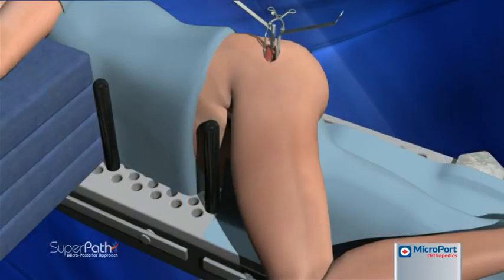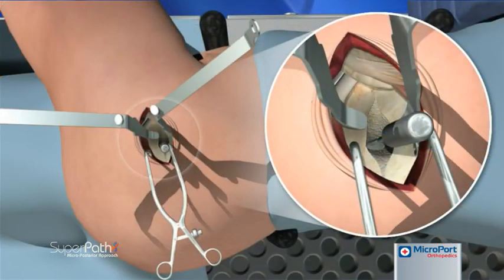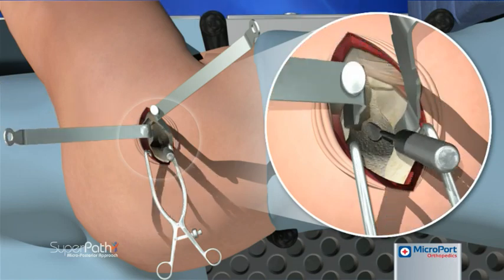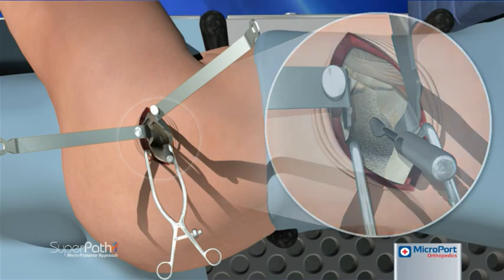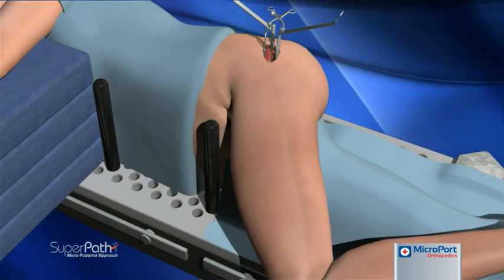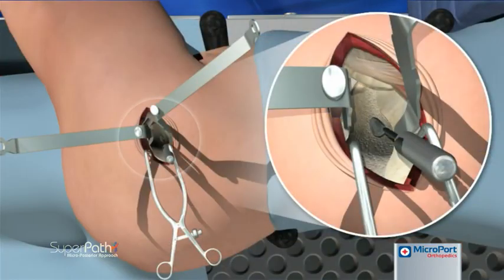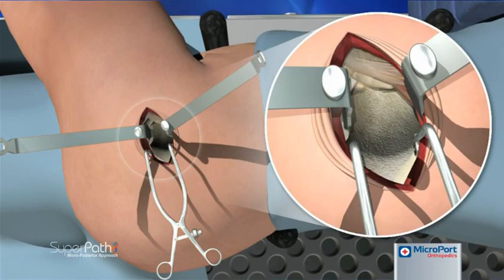With the knee lifted to reduce external rotator tension, a cob elevator is placed between the posterior capsule and the posterior femoral neck. The cob elevator is then replaced with the blunt Hohmann retractor previously located at the posterior capsule, and the knee is lowered to return the leg to the home position. The anterior blunt Hohmann is repositioned similarly, and the capsule is tagged for identification during repair.